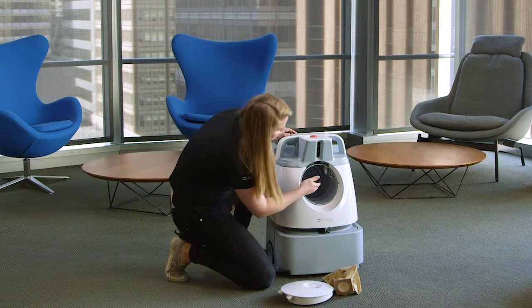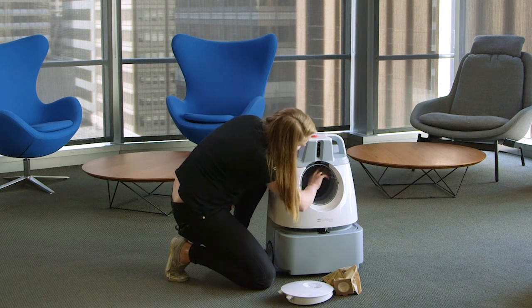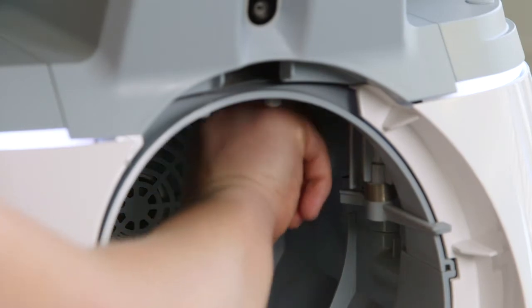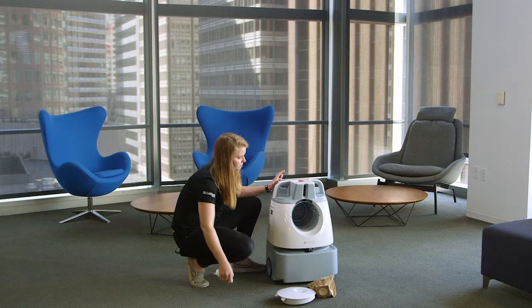What we're looking for here is the suction tube which connects to the bag. I'm going to take my two index fingers and reach into the suction tube to grab out any debris that might be in the tube.